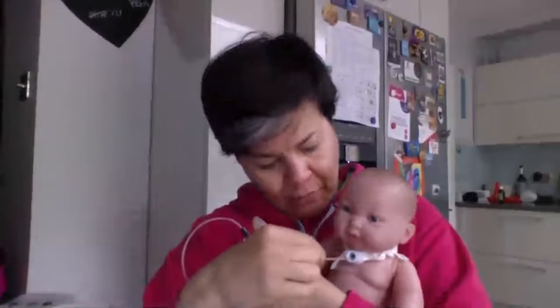So if this hasn't touched anything, I would go back in, take the finger off, go in, all the way to the end, until I can't hear anything. And if you listen to the child breathing, which clearly you guys can't because it's a doll, you can hear whether it's clear because it should just sound like, instead of, which is the sound that it makes when there's secretions in. When Zoe has secretion, she sounds like Thomas the Tank Engine. When she doesn't, she sounds clear and you can barely hear her breathing. So that's a day-to-day thing.